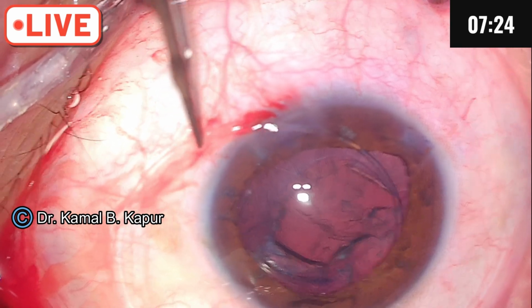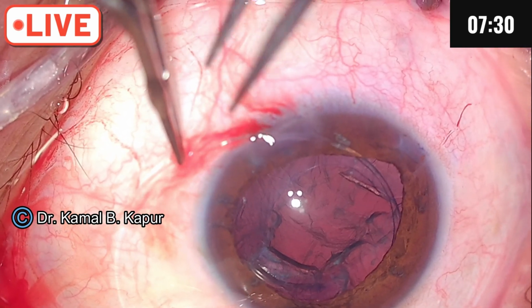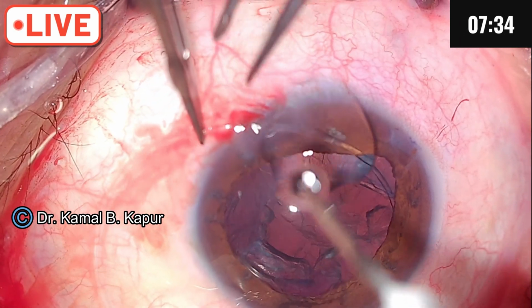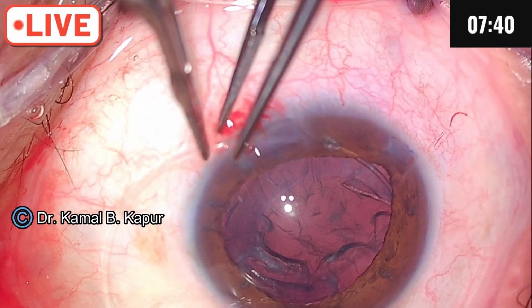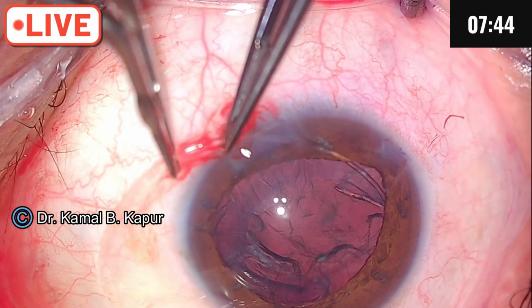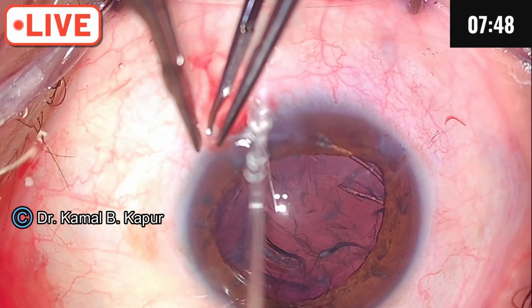Forceps, tooth forceps or suture tying. You have to keep dialing, making sure it doesn't come out. This is a dialing like a railroad technique.